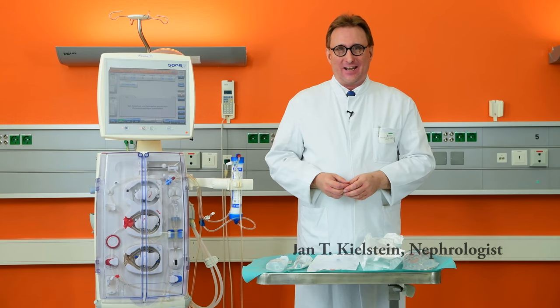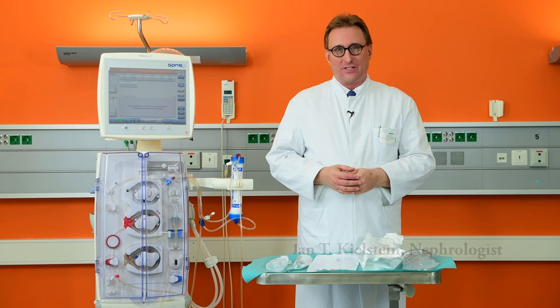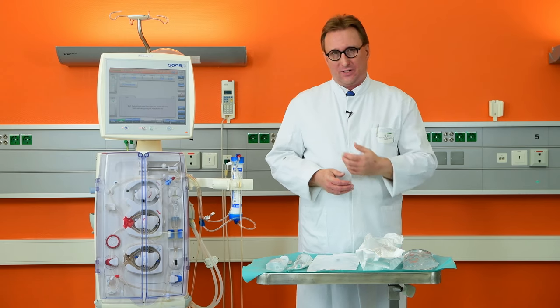Hi, my name is Jan Kielstein and I welcome you to our short tutorial on how to connect the Seraph blood affinity filter with a regular hemodialysis machine.